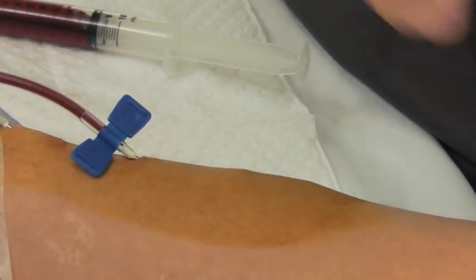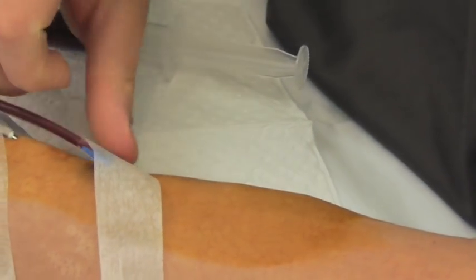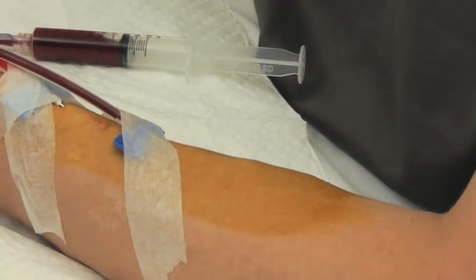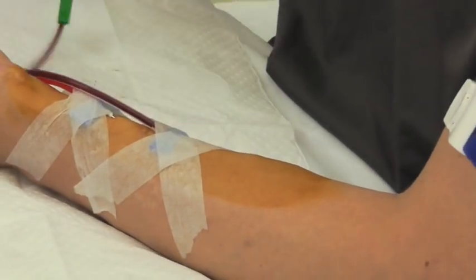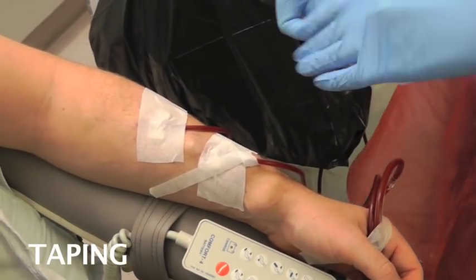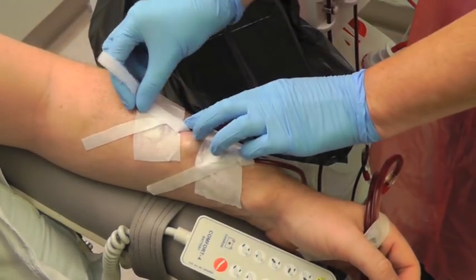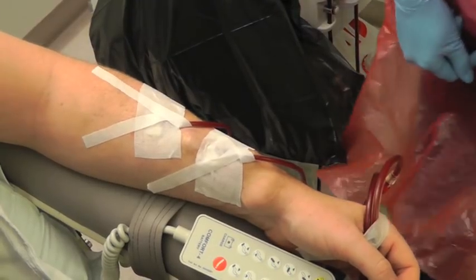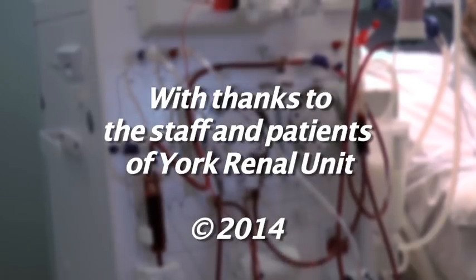If you find you can't get the needle into the tract and you take it all the way out, you must never reinsert the same needle into the tract because you will introduce particles that may cause infection. When the needles are in the fistula they must be taped securely. We normally use butterfly taping like this.